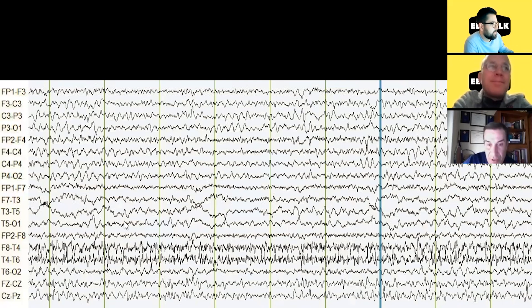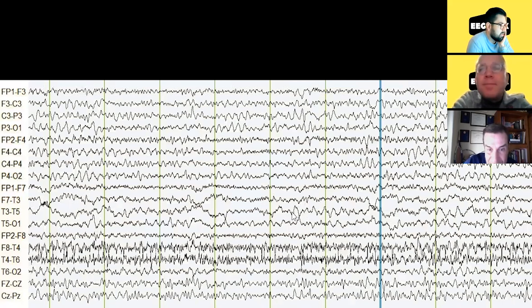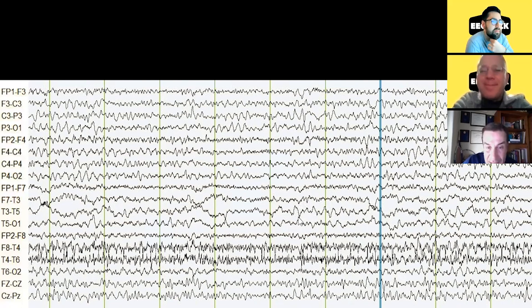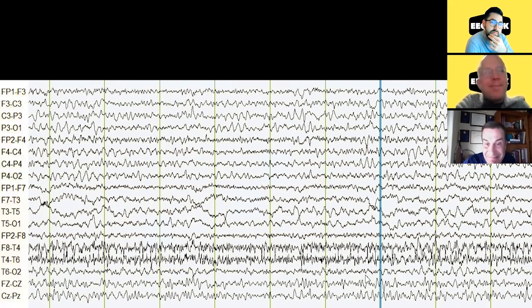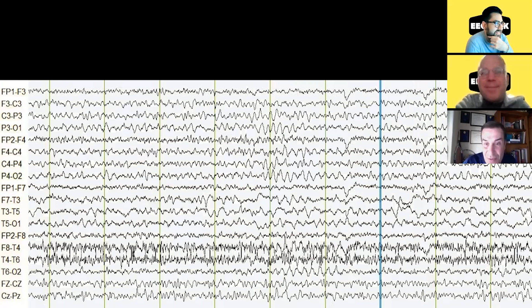We would like to see a phase reversal — how about these? I think these bother Fabio. They're all T5s. I thought they were all temporal discharges. T5 — that's definitely a phase reversal. So what does it mean? It means there is a maximum negativity here, so that discharge is maximum at T5. But does it in itself make it abnormal or epileptiform? That is the question, and the answer of course is no.